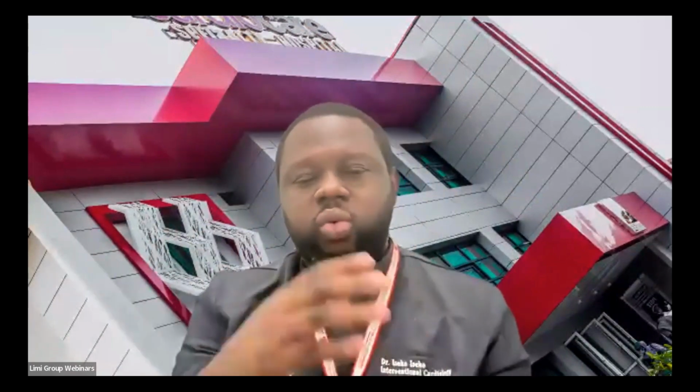Typically the main difference is that one was there before you did anything, and the other was there after you did something. It is not uncommon to have dissections while you're intervening, especially when you are doing very complex cases or very calcified vessels. What is more important is that you notice it immediately and you treat it immediately. Occasionally, once in a while, maybe 1 in 1,000, depending on how many complex cases you are doing, you will come across it in your practice. Once you see it, the important thing is to recognize it quickly and do what is necessary before it becomes severe or causes any problem.